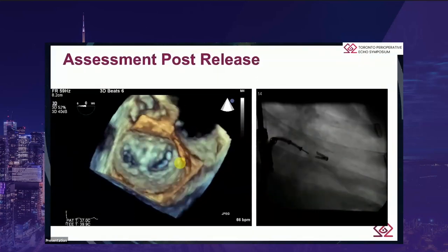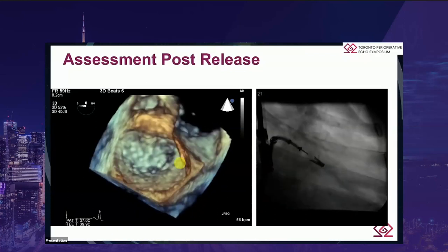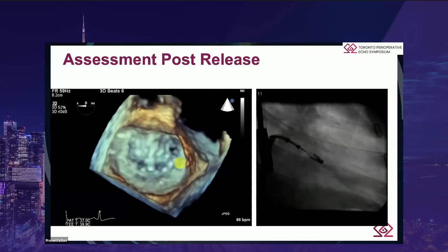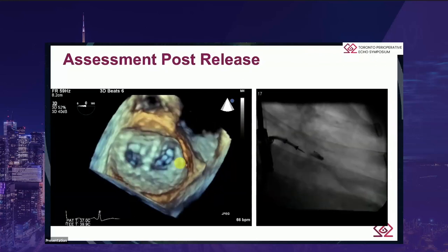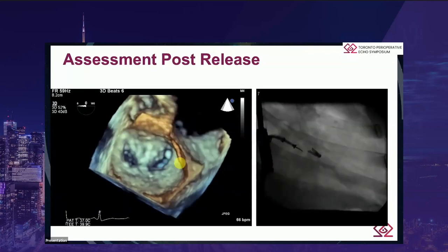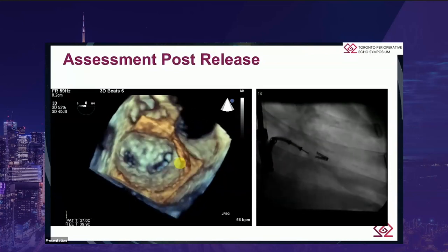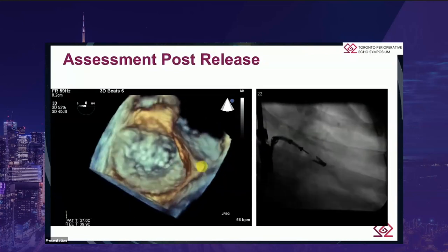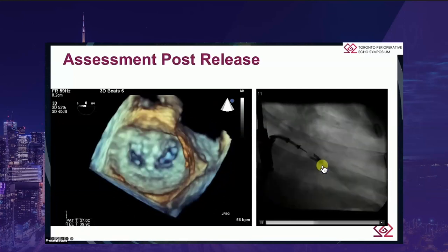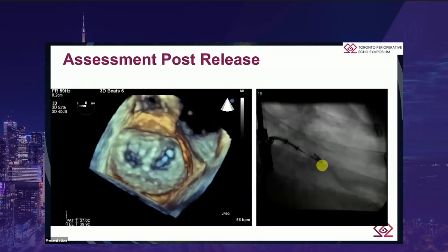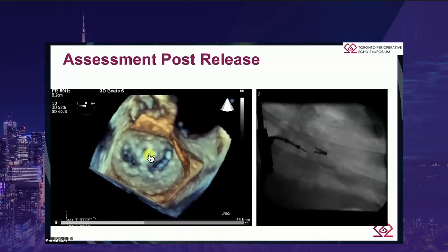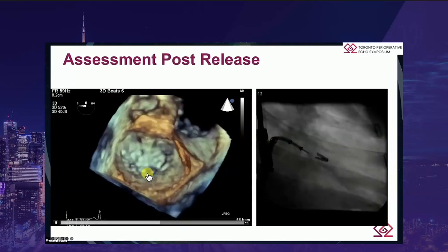Once you're happy with everything, repeat the entire assessment post-release. Unfortunately, sometimes clips can be held rigid by the delivery system, and it's not uncommon for the degree of MR to change post-release. On fluoroscopy, you can see this clip is nice and stable, not moving — reassuring that the clip is well attached. This nice tissue bridge and tension on the leaflets is another good sign.